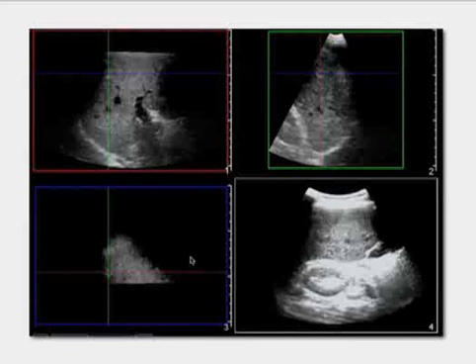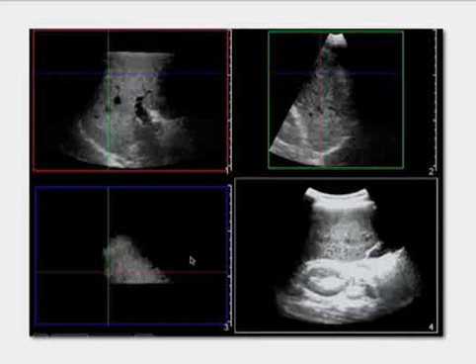This happens to be a hemangioma. In fact, this is my own liver. These images were acquired about five or six years ago, and I know it hasn't changed since.